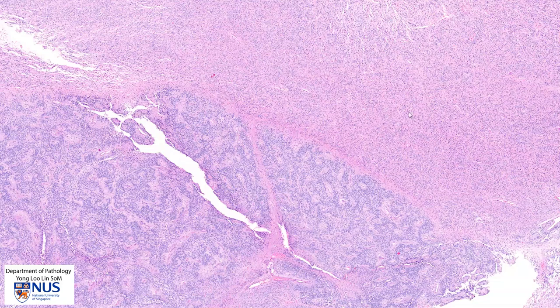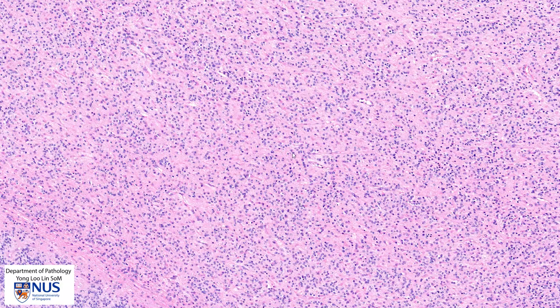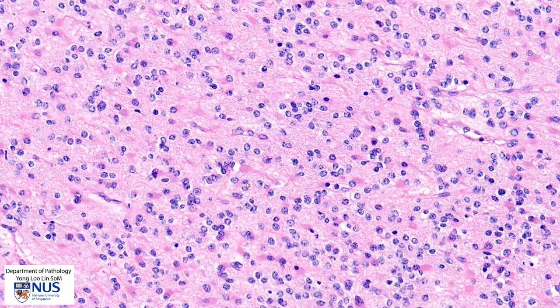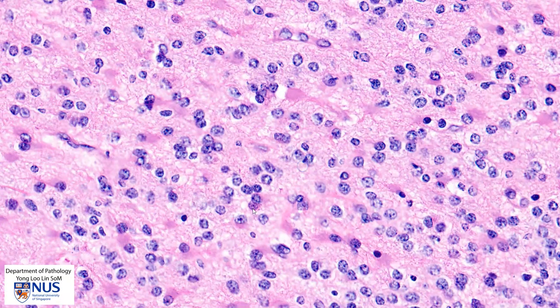Let's first take a look at this pinker area. On higher magnification we can see that it is composed of relatively uniform cells with quite small round to oval nuclei. We can see that the nuclear membranes are smooth and on higher magnification we can also appreciate that the chromatin is relatively speckled or quite coarsely granular.